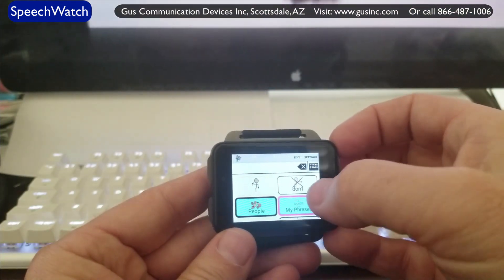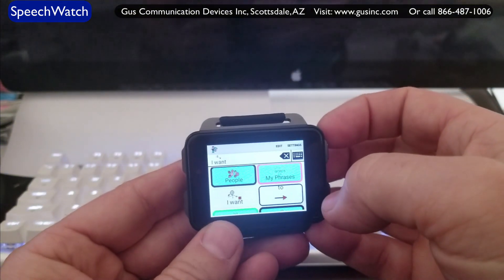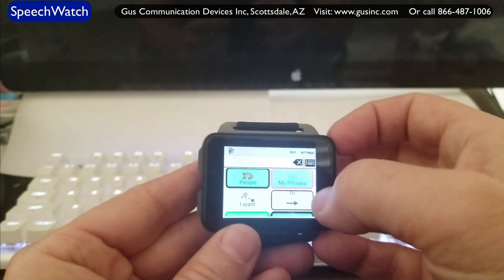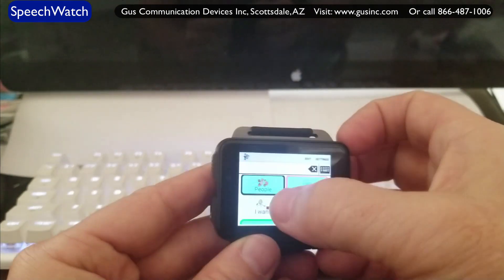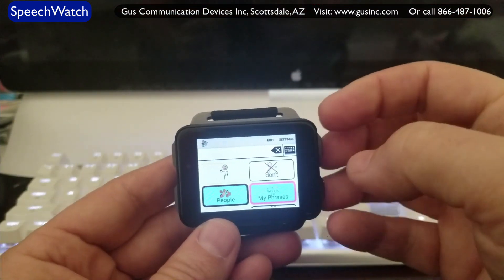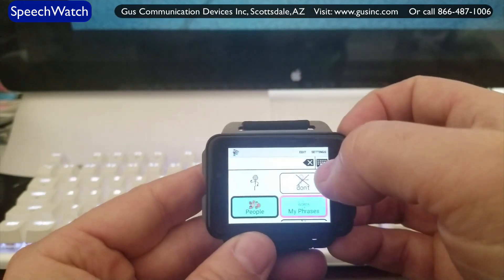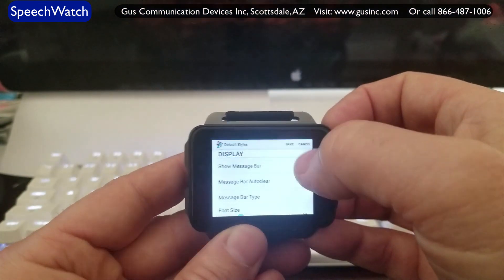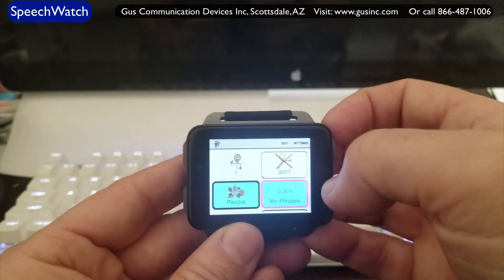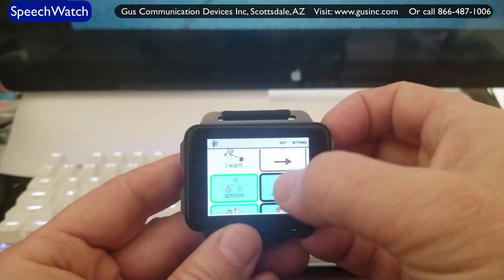You have the message bar across the top. If I touch on that, things pop into my message bar. I can also bring up my keyboard — for example, I could say 'I want to go to the store,' combining symbols and text, no different than our Android app. Or if I decide I don't want to see that message bar, I can go into settings, default styles, turn the message bar off and go back. Now I have no message bar. I can just use phrases that I already have.